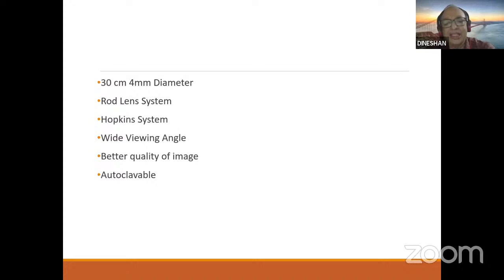And also for resections or procedures, you use the 30-degree. So when you have a wider vision angle, nowadays the Hopkins 2 30-degree will do the whole job of the 70. So 70 is nowadays not routinely used except in certain specific situations that I will come to later when discussing other equipment.